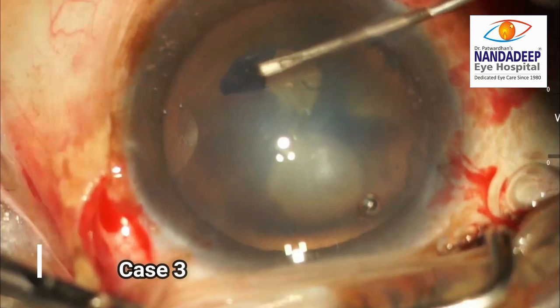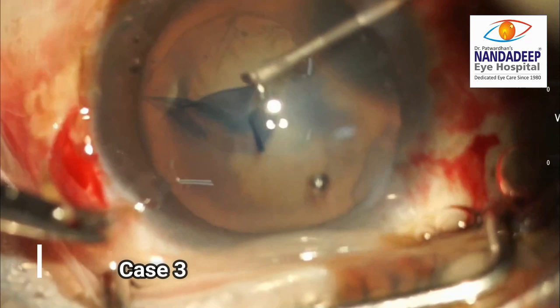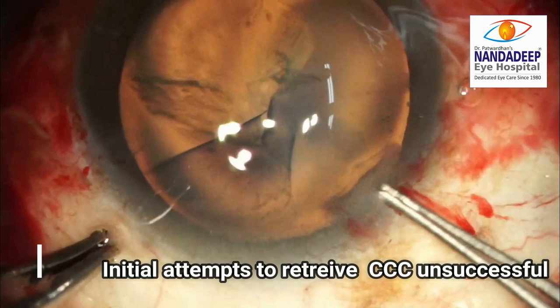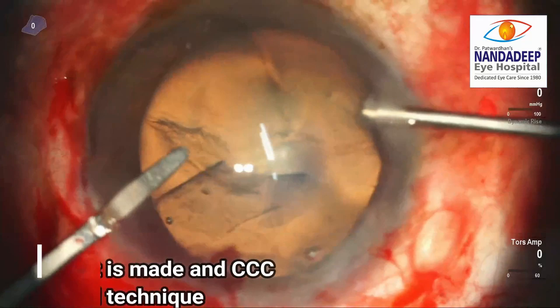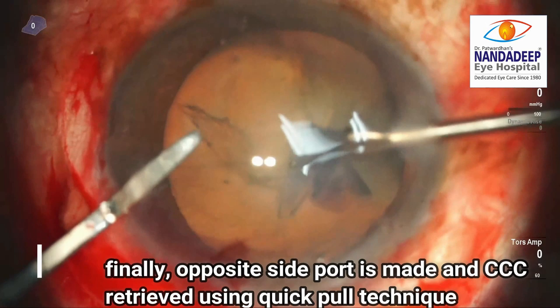In the third case, the surgeon has started the rhexis normally but the rhexis extends to the periphery and to the zonules. The initial attempts to rescue the rhexis are unsuccessful. However, a microcapsulorhexis forceps introduced from the opposite end and the quick pull technique help in retrieving the capsule rhexis.